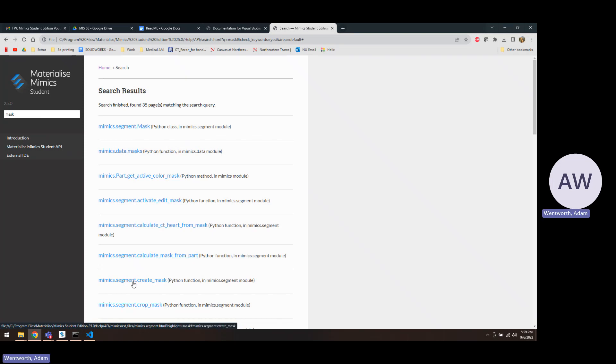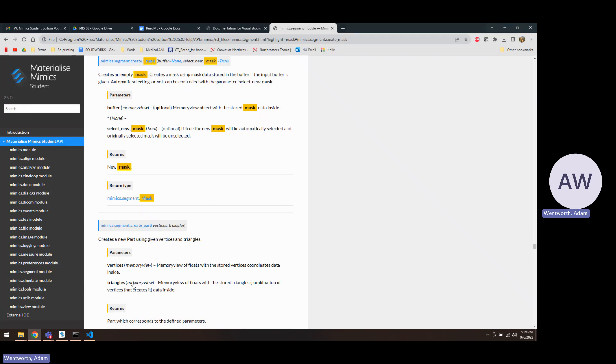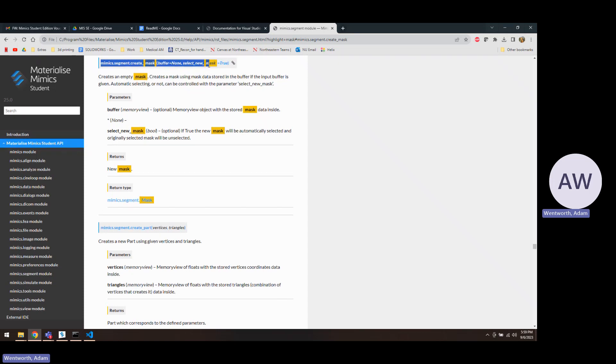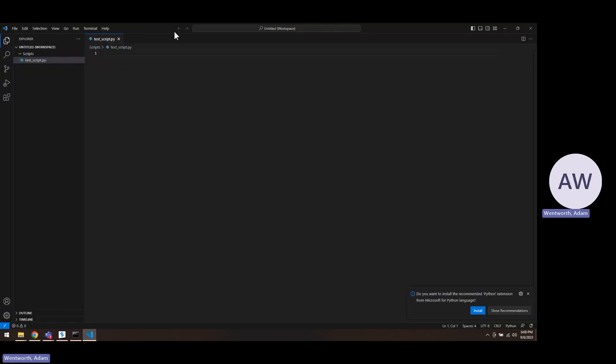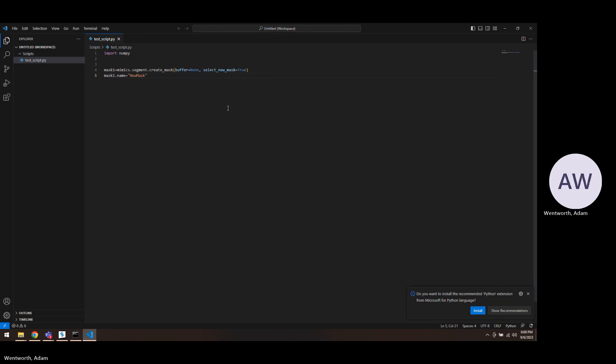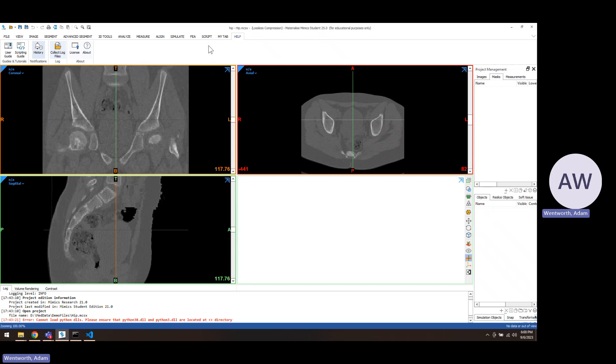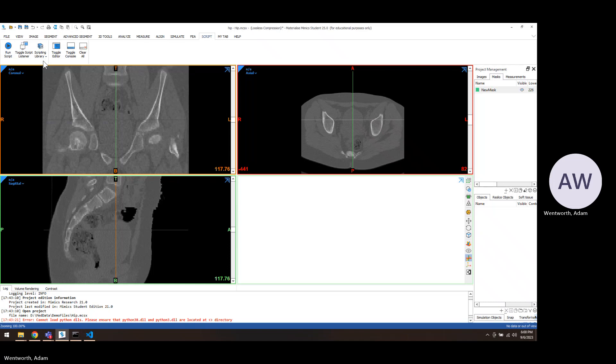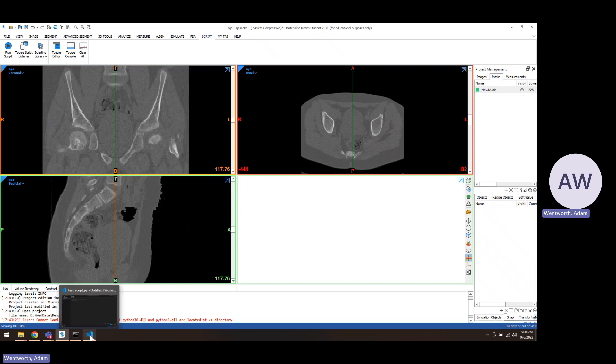If you want to create a mask, that might be like the first thing you do with segmentation. You'll have this little chunk of code here and you can just copy this and paste it into your code. Typically, the first things you would do are like importing libraries. Then you can paste that code that you've got and you can make a mask with naming. So that would make like a new mask, so we can run that and see if it actually works. So there we go, it made a new mask and it renamed it what we wanted.